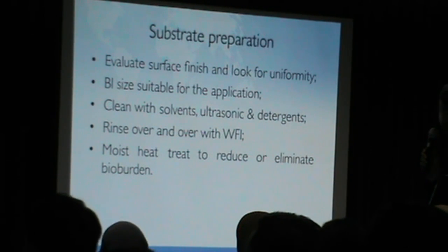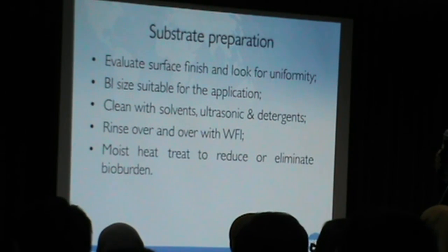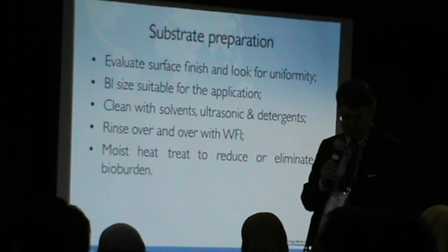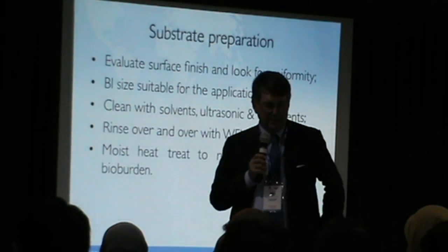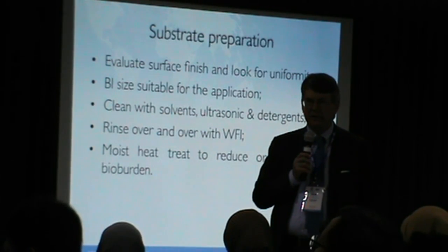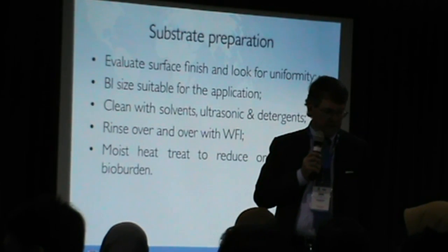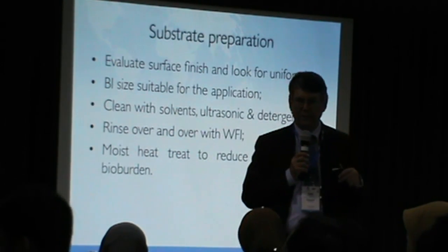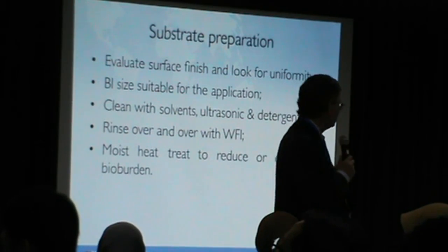The substrate preparation. You need to have a very nice finishing of the surface, because if you have a surface with cracks and crannies, then your spores are hidden, and the vapor or the steam or the gas or the dry mist are not able to penetrate, and therefore they are not killing your spores.